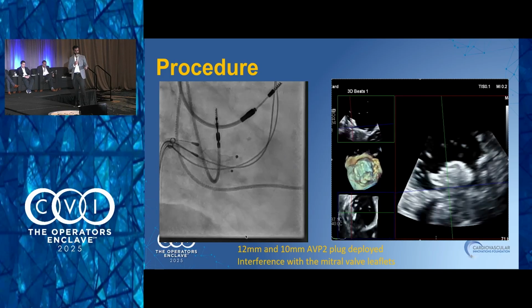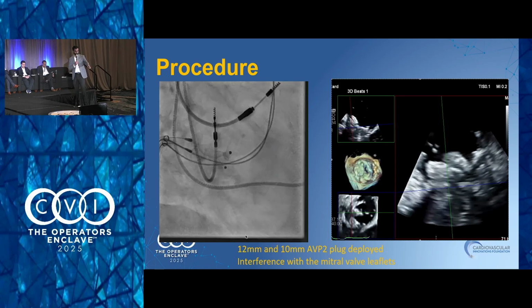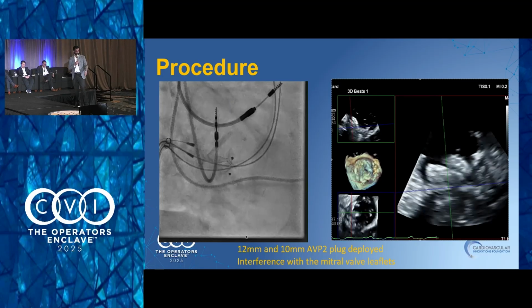Again, it didn't really sit right. Our gradient shot up. You can kind of see the 3D picture right in the middle. One of the leaflets doesn't open as well with this approach.